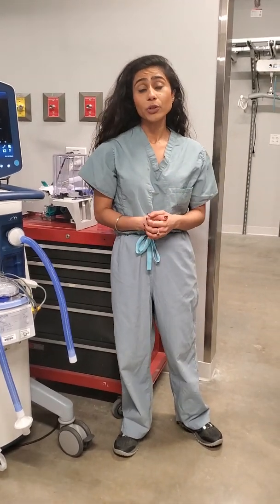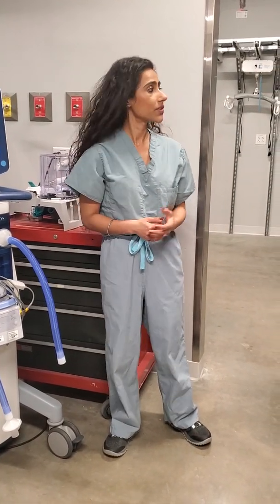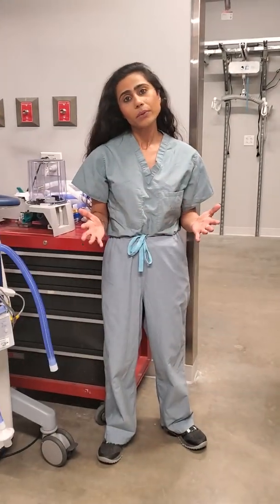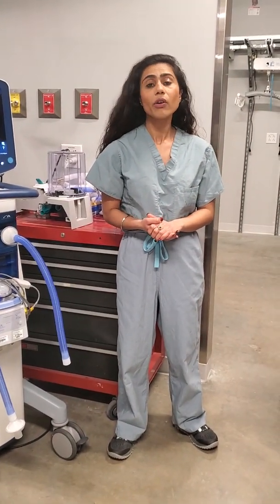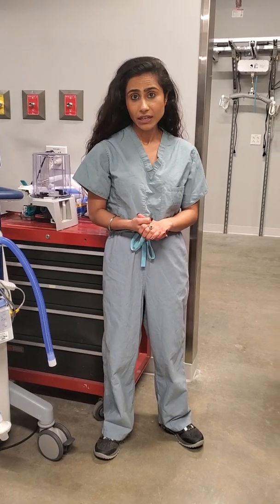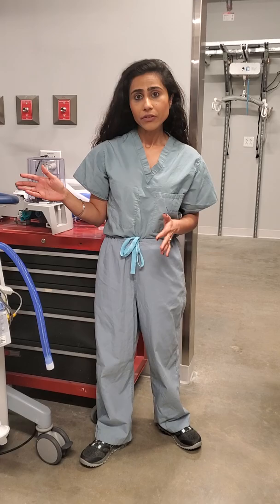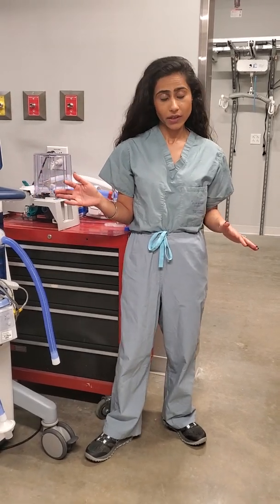Hello everyone, I'm Simba Coramada. I'm an intensivist. This is Kelly, she's our respiratory therapist. While we're grappling with the COVID pandemic and worried about running short on ventilators, I would like to demonstrate how we can split one ventilator between two patients.